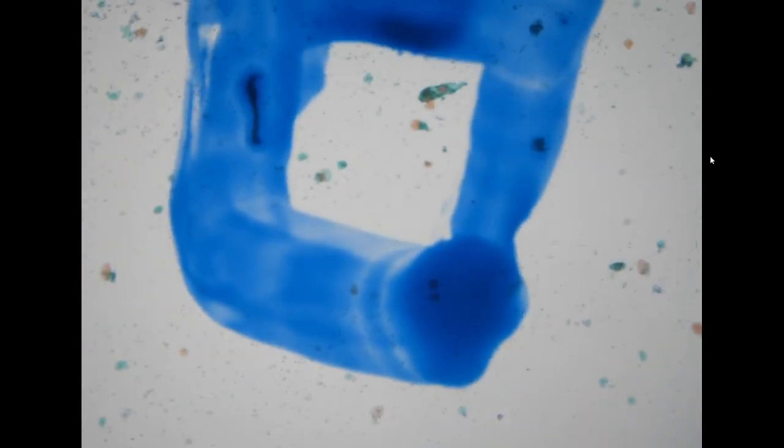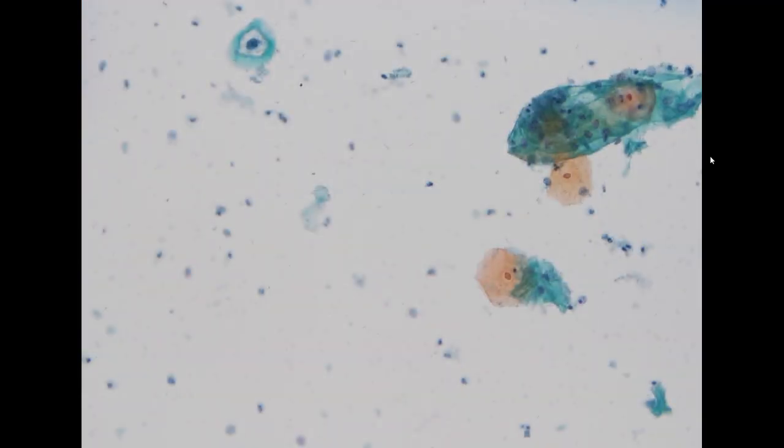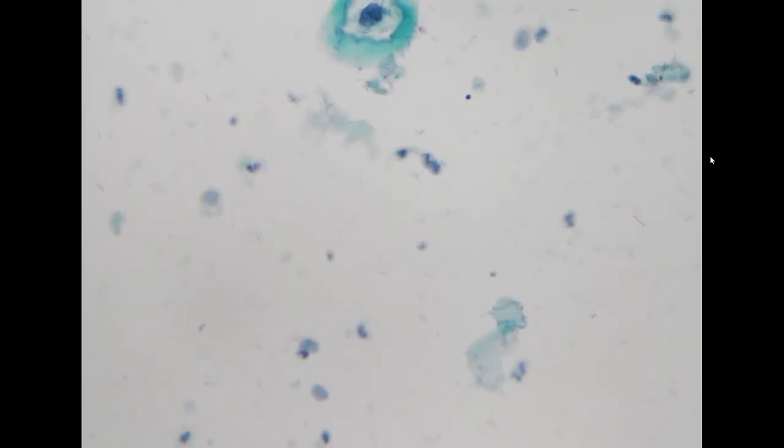So finally, this is a Pap smear. This is a relatively young patient who had a past history of condyloma. Condyloma is considered equivalent to LSIL in the pathology classification.